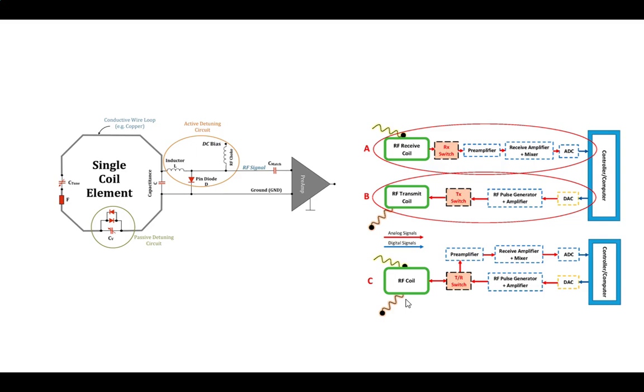But essentially, think about this, right? I've got a coil element. Imagine this is one of my signal coils. I add a preamplifier or some type of op-amp setup in here. There are a few things I'm going to want to do to tune this to be able to read different areas very precisely. Again, this helps me reject other areas that might have gotten some slight amount of excitation. I can also tune this to reduce some of the readout. The primary ones for doing your tuning are these two capacitors, because you're not really changing the coil itself.